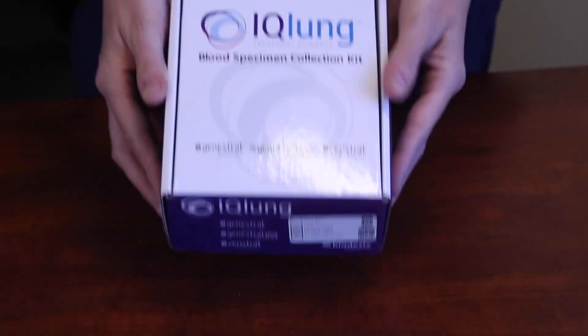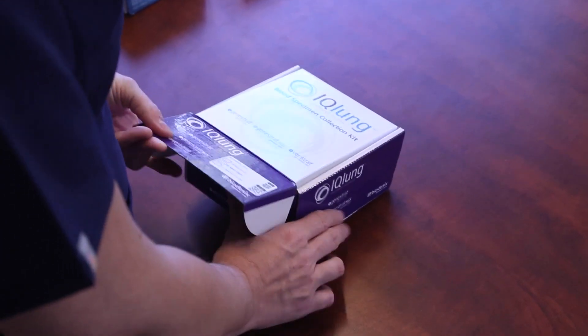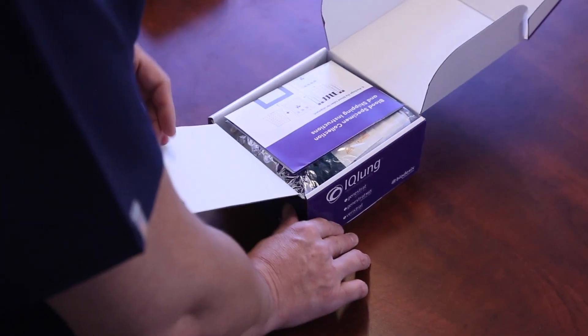Collecting a patient sample for IQ Lung testing is easy using the IQ Lung blood specimen collection kit. First, open the IQ Lung kit and remove all contents.